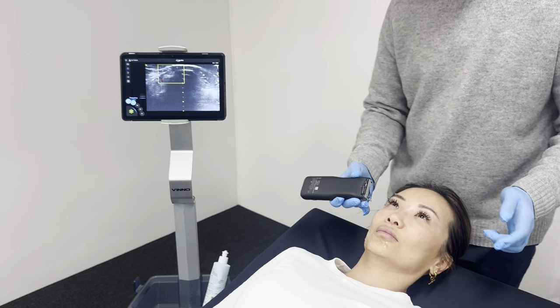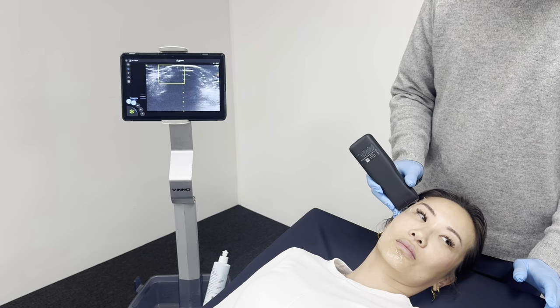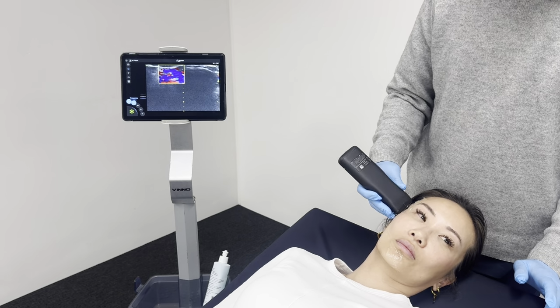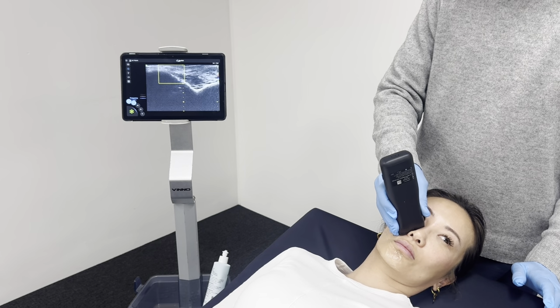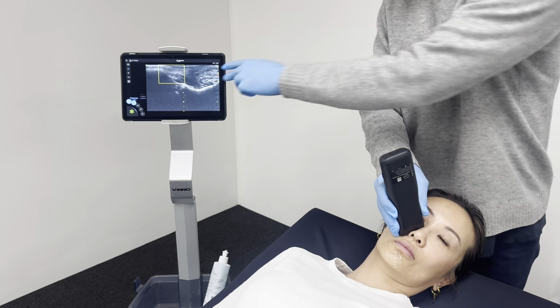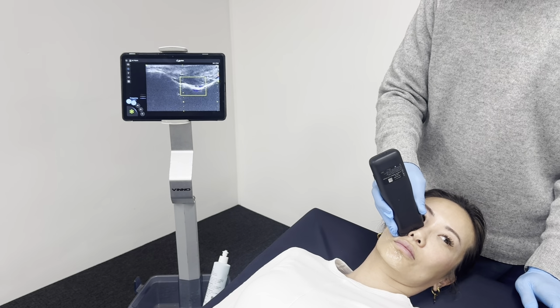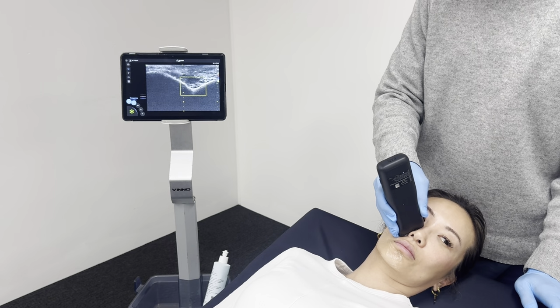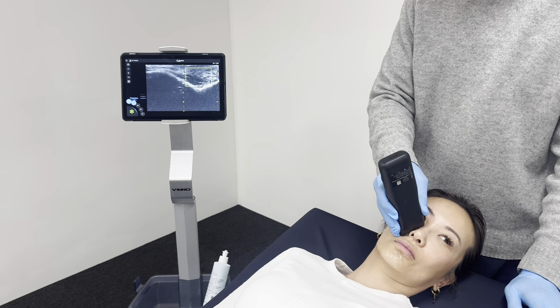Now if we just go straight into the mid-face, if you just bring your head over that way. So my position for the temple is here, and we're going to take some gel and we're just going to go down into the middle of the face, and we're going to find the piriform space, which is this area down here in the middle of the screen. We'll bring the probe to the nose and we'll see if we can find where that angular artery is, which should sit in this area somewhere.